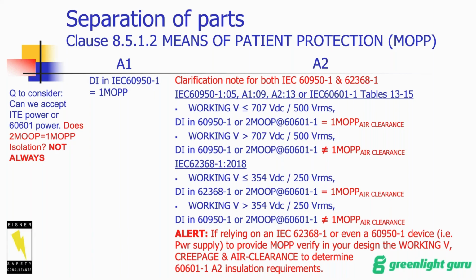and you go to a test house and you get to the end of the test program and they tell you you don't meet it, you're in trouble. You just lost all those months of testing, potentially, if they don't tell you early on, which some test houses do, some don't.